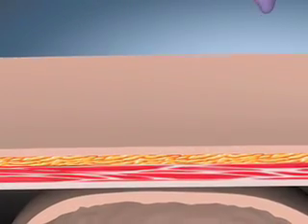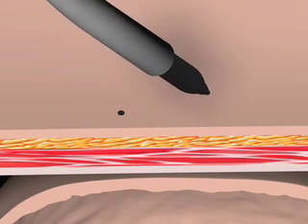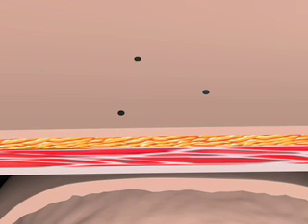Placing the safety pexy. Place a skin mark at the tube insertion site and define the gastropexy pattern by placing 3 skin marks equidistant from the tube insertion site and in a triangular configuration. Allow adequate distance, approximately 2 centimeters, between the insertion site and safety pexy placement so as to prevent interference of the anchor set and balloon once inflated.